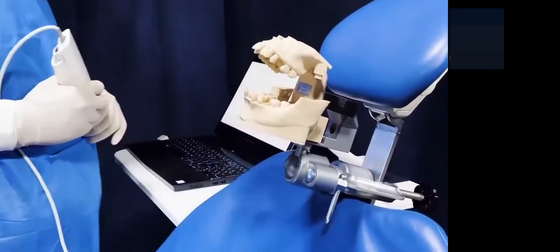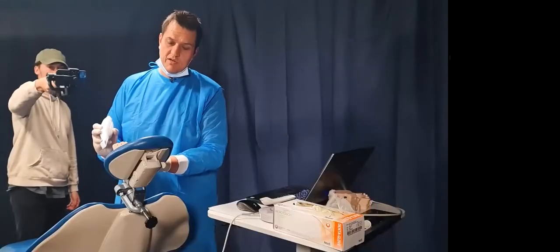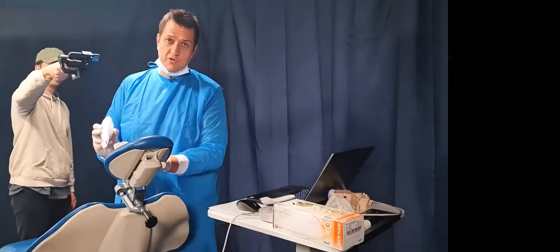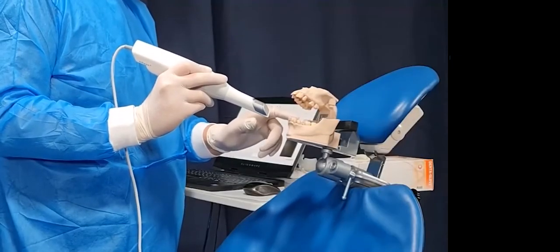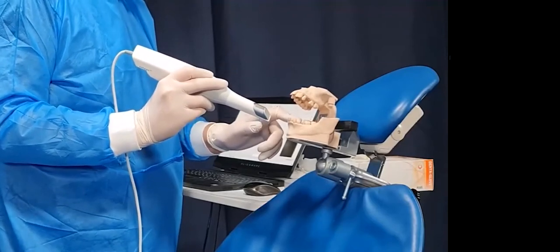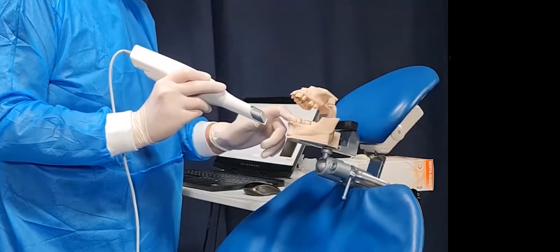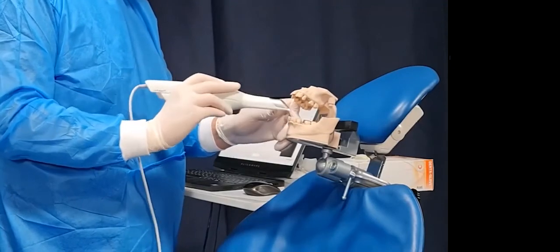Now the first thing that I do is for a lower scan, now I do go into the sulcus depending, but if I'm going to be working on this quadrant 3 missing premolar, I would typically put my index finger on the occlusal surface of the quadrant 4, opposite to that space. Now that gives me a lot of space to be able to get my thumb supporting the head.